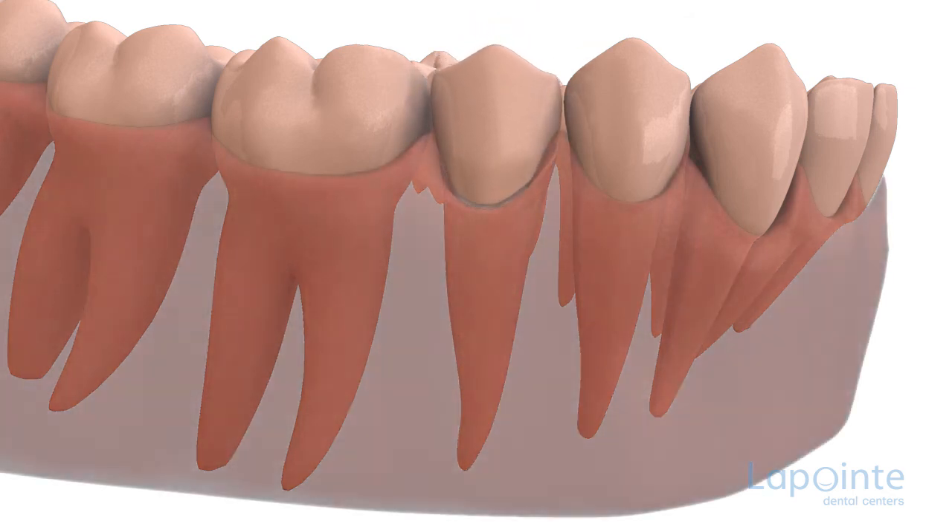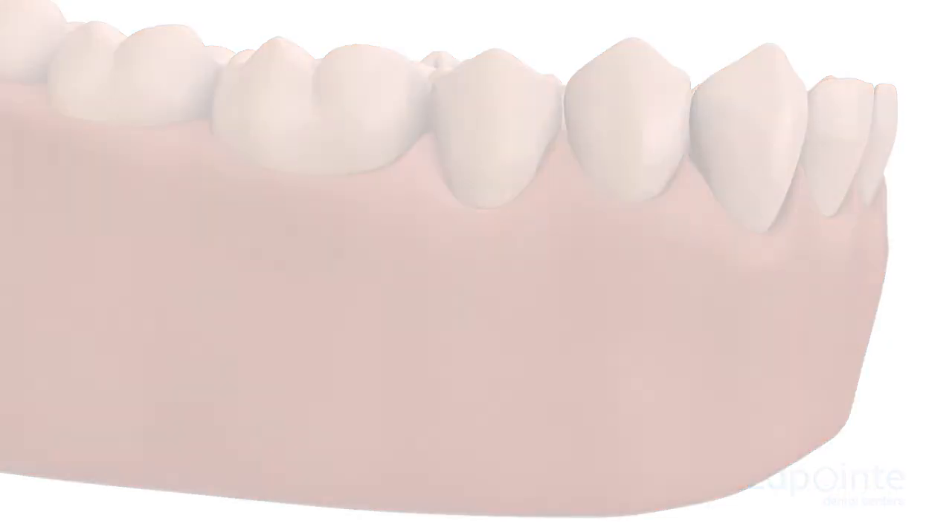Once the post is properly anchored and the excess product has been removed, the stump will be rebuilt in preparation for a crown.